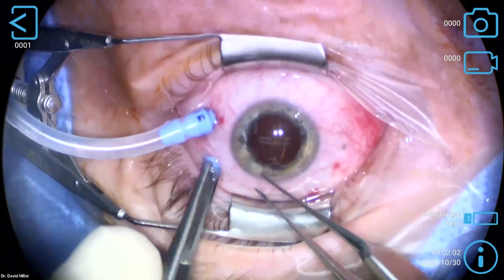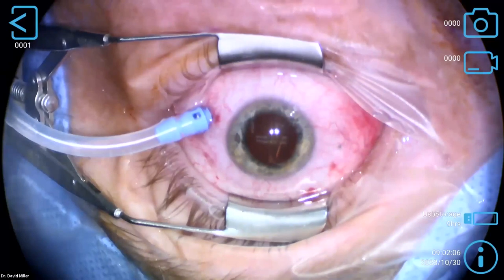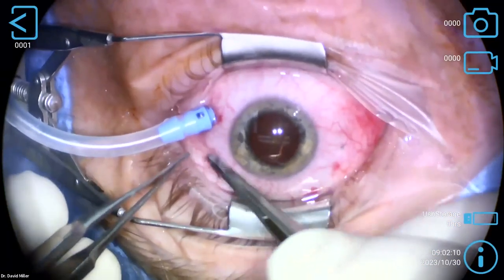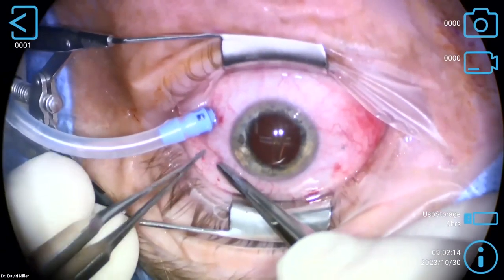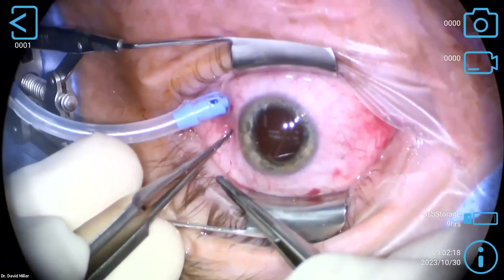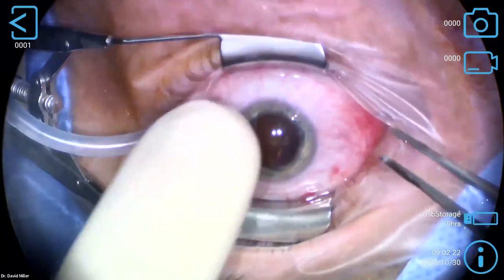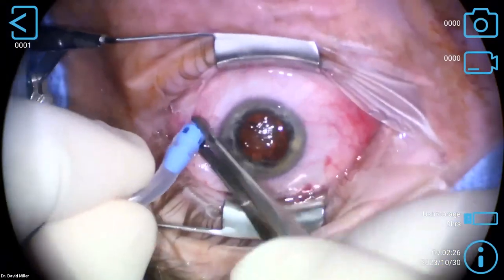This cannula went in on an angle, you know, like this. So if you can imagine, you can just see the wound right there. So I'm going to go just posterior to that, just inferior to that, go over the roof of the wound and collapse it. I pressed hard enough to make a little bruise on the sclera there. And we're good on the pressure, right? Here we're down, same here.